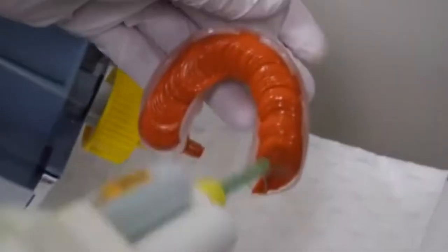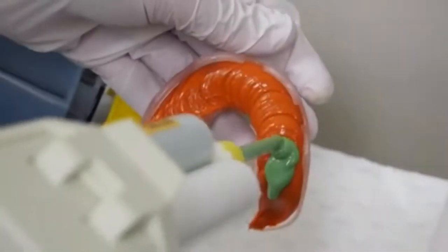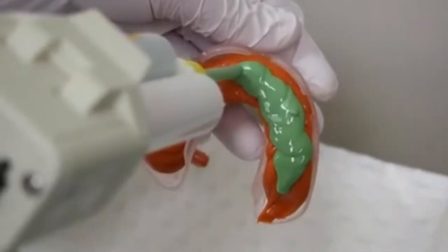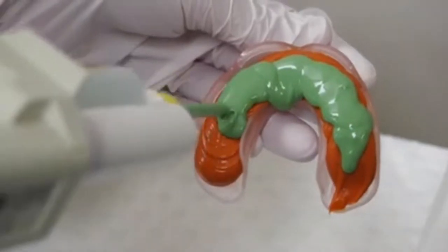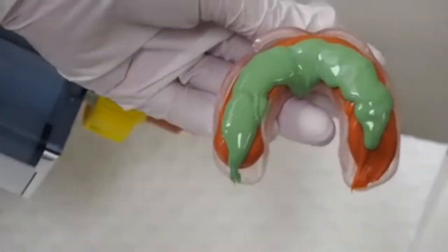When you get the light body, you do the same thing. You hold the light body at 90 degrees to the tray and let it squeeze and spread out. If you start waving the nozzle about, you'll get bubbles which will then affect the teeth.